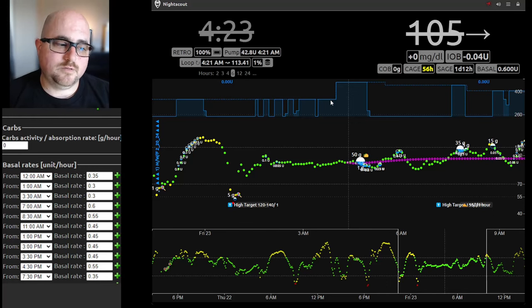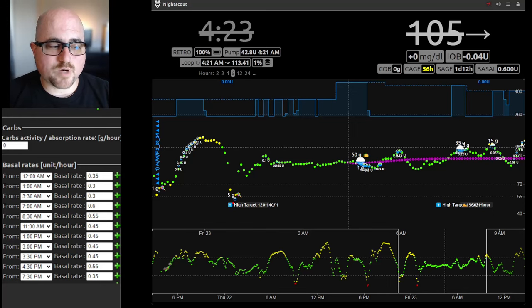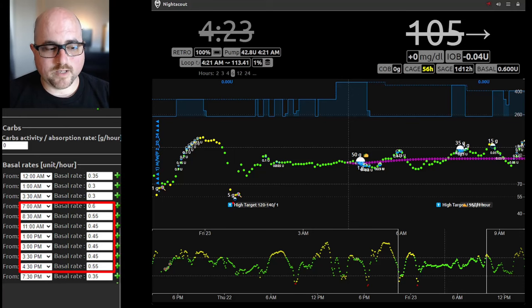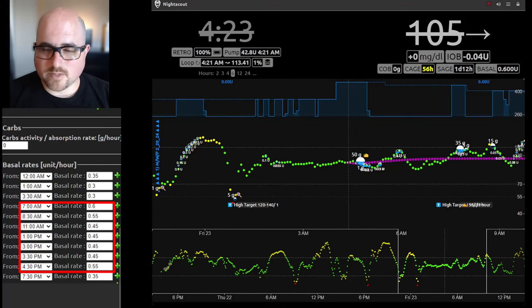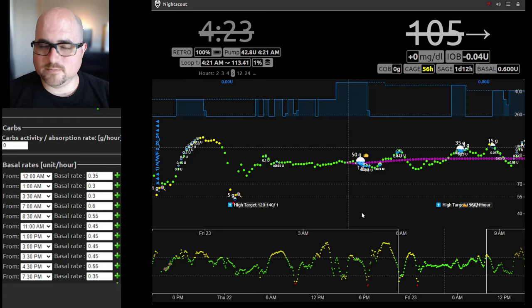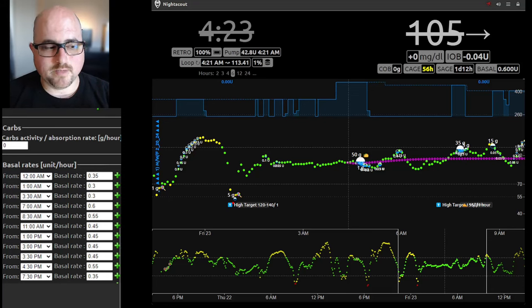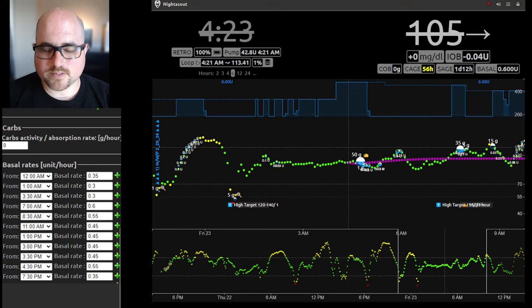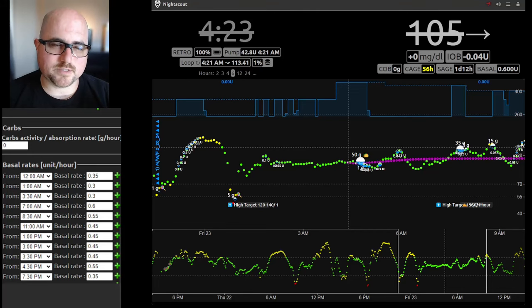I would immediately look at changing the daytime awake rates — from the 0.6s, 0.5s, and 0.4s down to around a 0.3 or 0.35. But before we say yes to that, let's look and see how the day is going. Most often you might have a little bit of a 'feet on the floor' morning rise that's often being managed here. So Brandy, are you experiencing that? Is that why there's a 0.6 jump at 7 AM, or is this mostly because of breakfast?